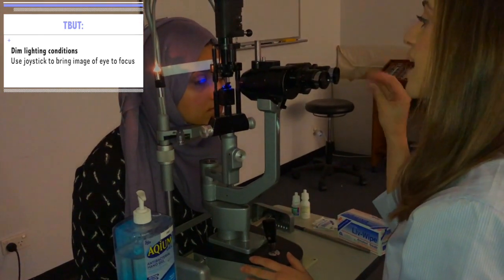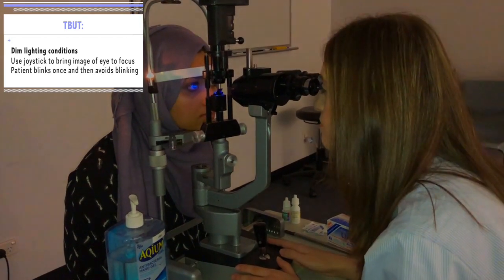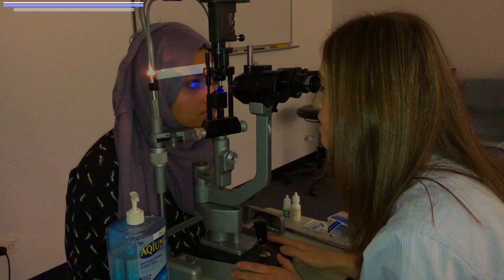The patient is asked to blink once and instructed to keep eyes open while the tear film is being observed. The examiner then commences counting in seconds until the first appearance of dark spots occur on the cornea. This is recorded as the tear breakup time.